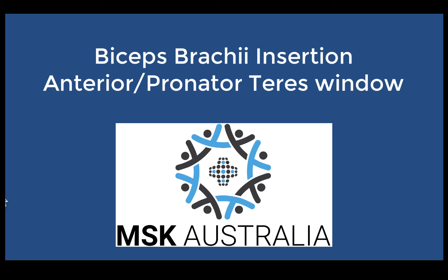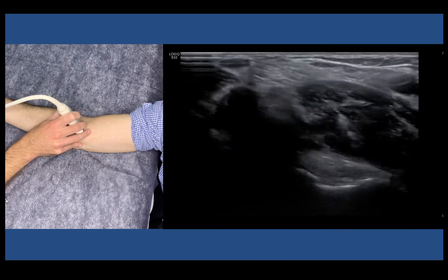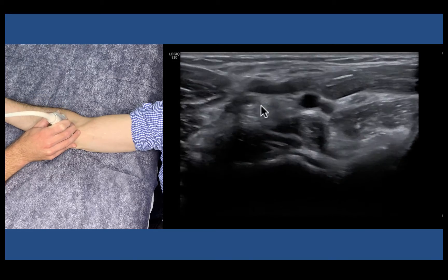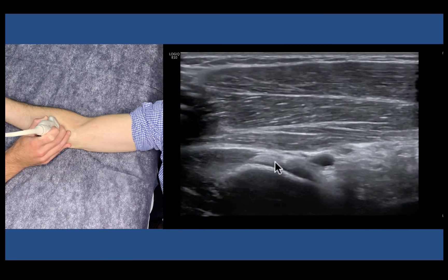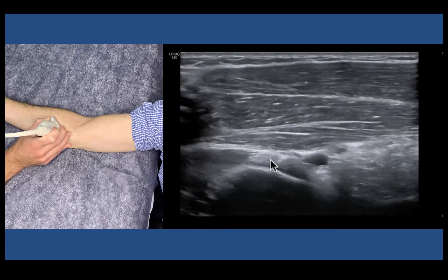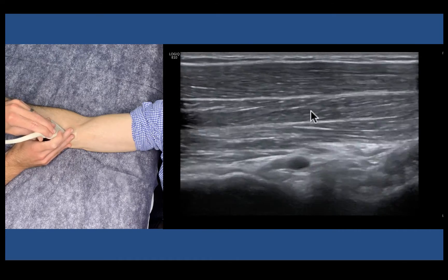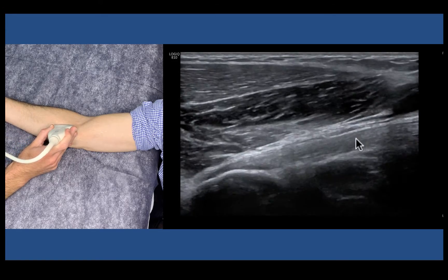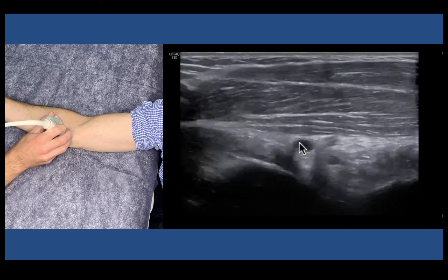This is probably the most useful view that we have and gives us our most diagnostic information. We're going to come short axis down the arm, follow the biceps at the musculotendinous junction, follow it down as it forms its common tendon to come down and insert onto the radial tuberosity. To get this window we need to have our probe quite medial on the patient's forearm and be looking through pronator teres. We're turning longitudinal here to assess the tendon, and here we have pronator teres as our window that we're shooting through, and we can see the tendon nicely.